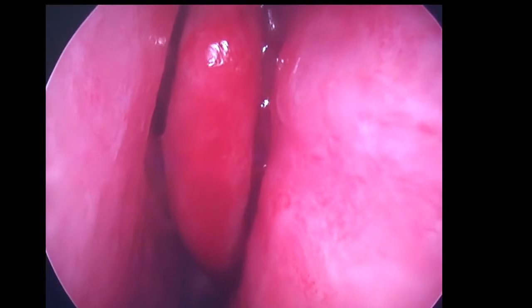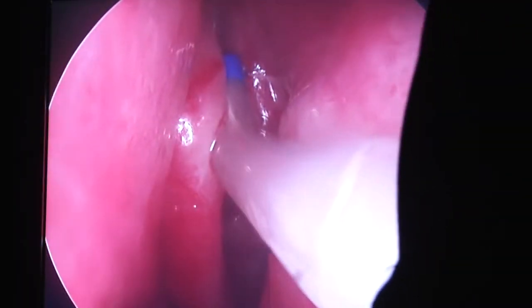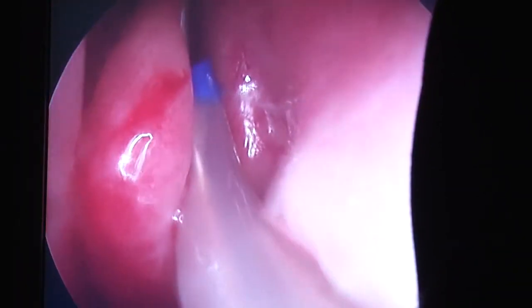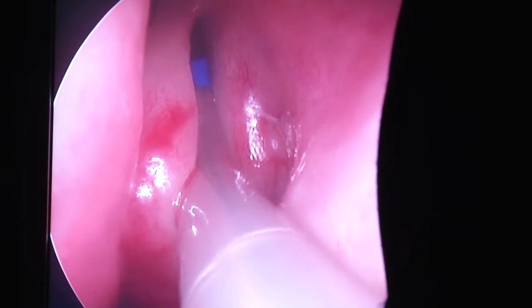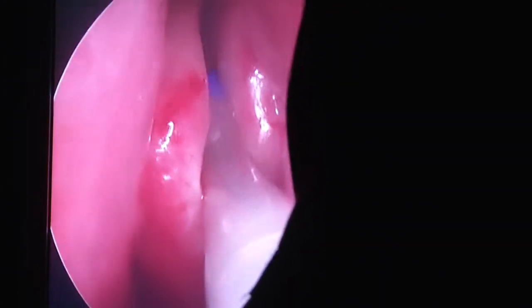Now I'm going to take the balloon and slide it in with the camera into that side area where you just felt that instrument go. There will be a little bit of pressure — it's going to be a little dark, and you may feel a little bit of movement of that cord as it slides up inside the sinus. You'll feel me touch and move until I get where I need to be. I'm going to slide up just a little bit higher. I'm seeing a flash in your forehead, so I think we're inside that sinus. I'm going to advance the balloon, and Julie's going to inflate it.